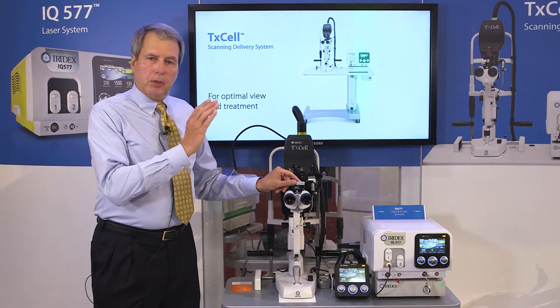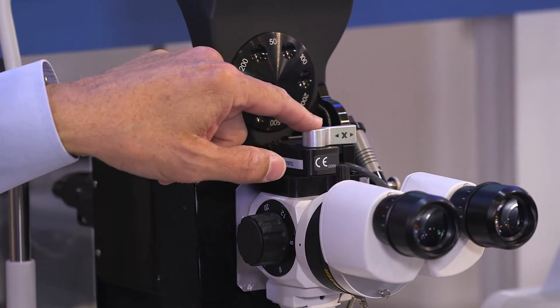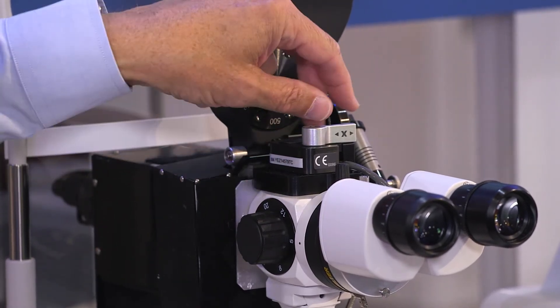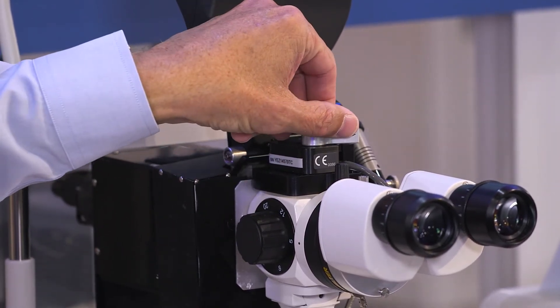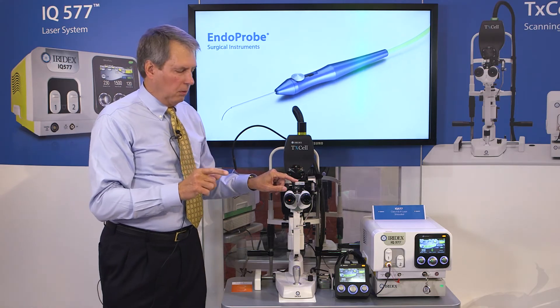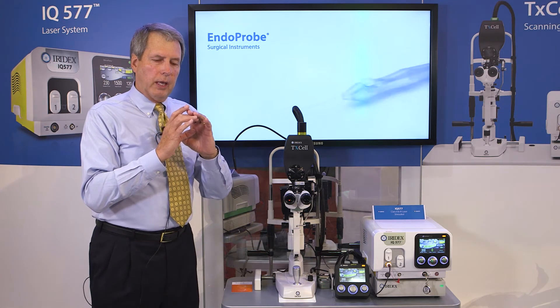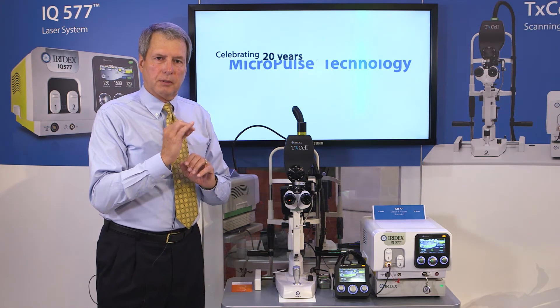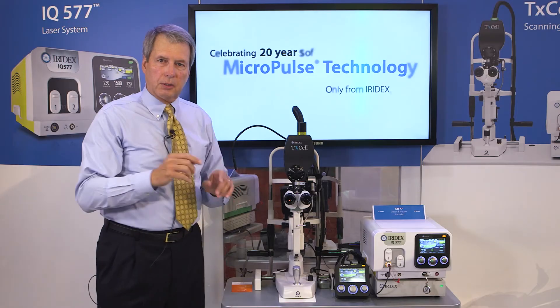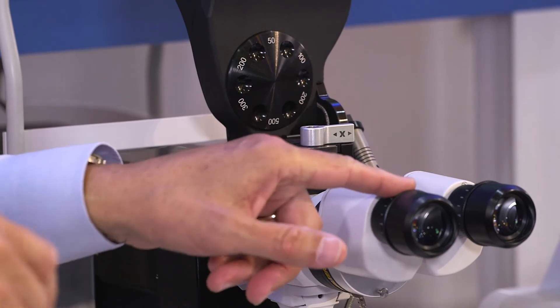If the aiming beam is off horizontally, you'll use the horizontal adjustment — in this case it says X, the same X as you have in a graph — and just turn until it moves into view. You can also use your illuminated spot and adjust that to the smallest configuration. At that point, you can adjust the horizontal and vertical axis of your aiming beam, put it right in the middle, and you're right in the center of that visual field.